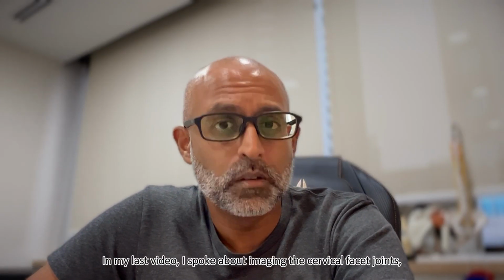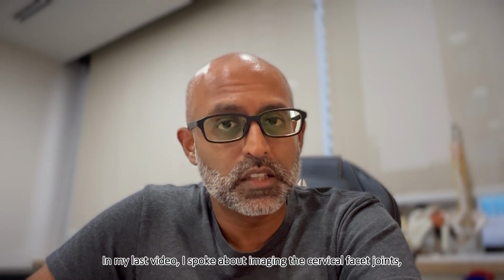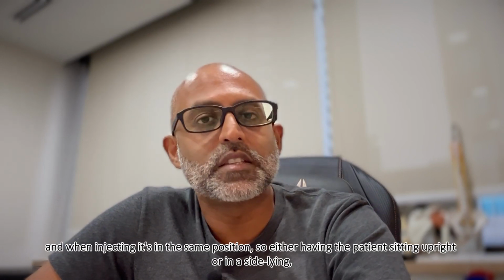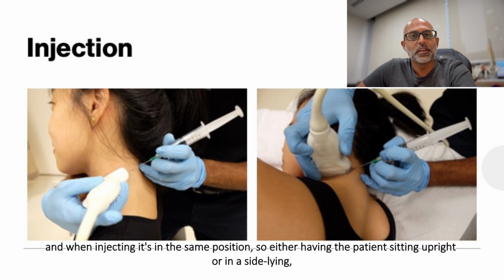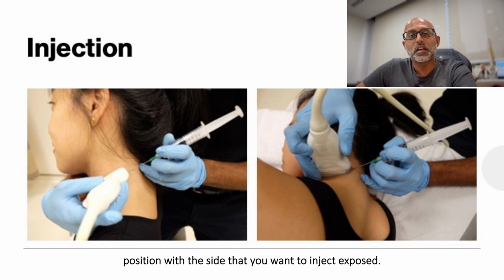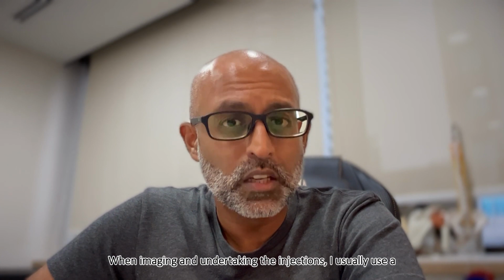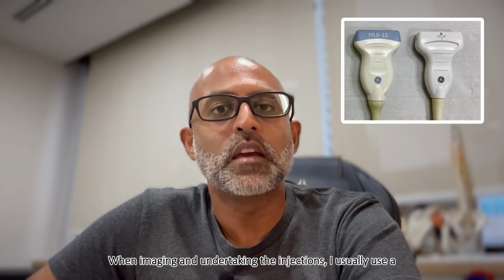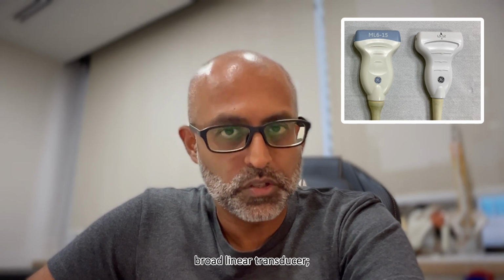In my last video, I spoke about imaging the cervical facet joints, and when injecting, it's in the same position, so either having the patient sitting upright or in a side-lying position with the side that you want to inject exposed. When imaging and undertaking the injections, I usually use a broad linear transducer.